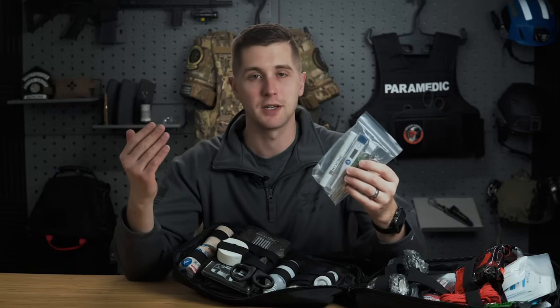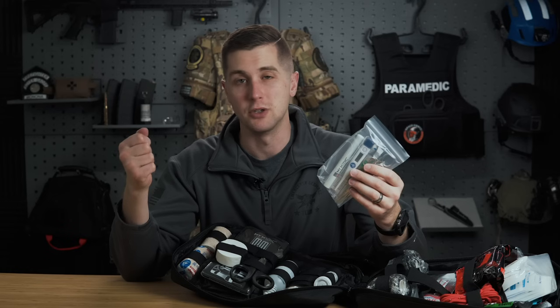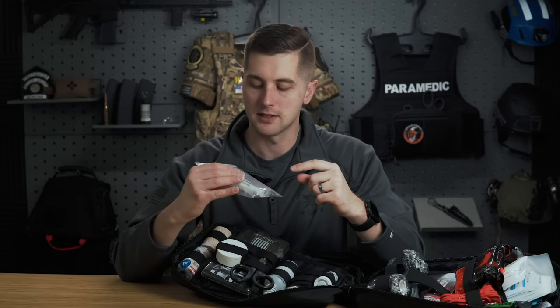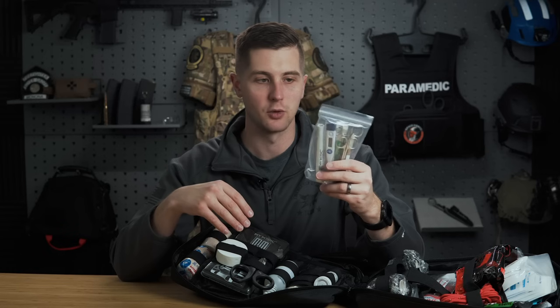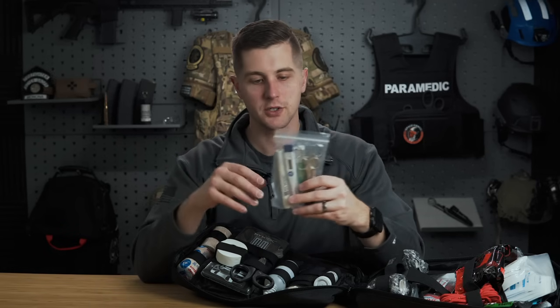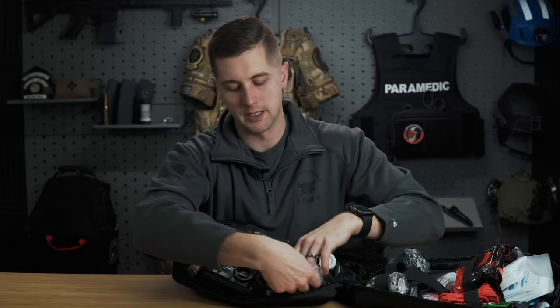I use it a lot to cut the pressure on a blood pressure cuff. You can use that as a makeshift tourniquet, or you can use that as a pressure bag on a bag of saline in the professional world. It also has two different sizes of tweezers in here and some bandage scissors, depending on what you need. You also have a tongue depressor, and it's just a good little packet to have all in one place for your more minor items.